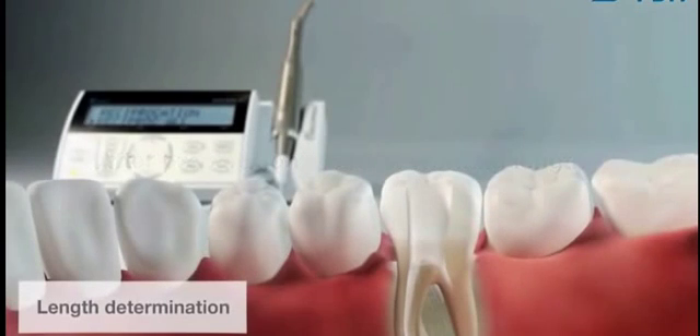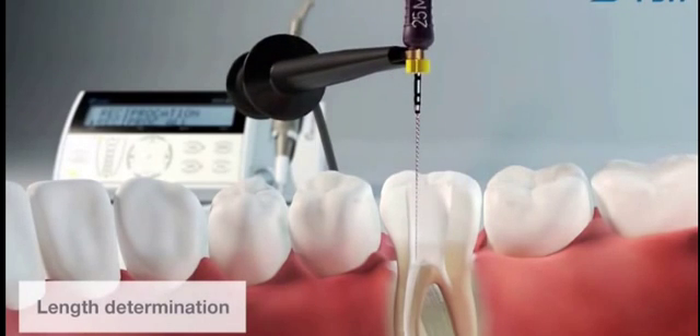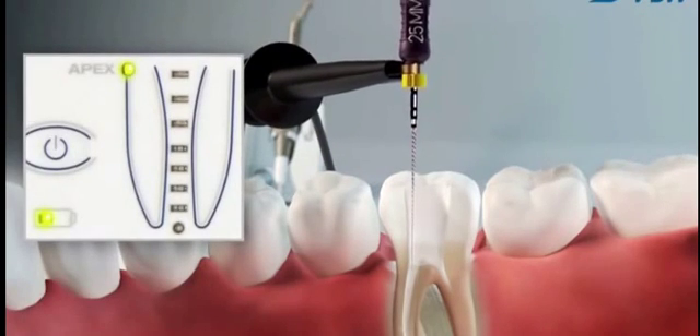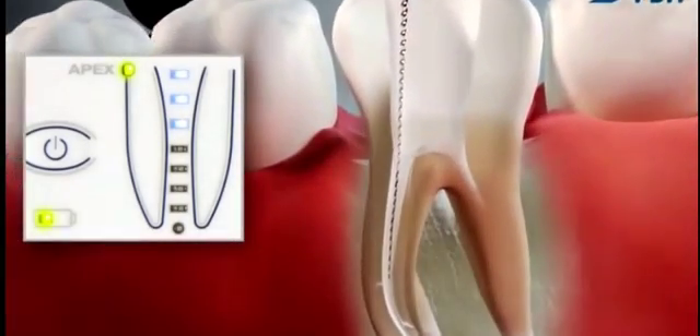Working length is now determined electronically with the help of a VDW Gold Reciproc. A C-Pilot file size ISO 10 is used both to measure the length of the root canal and to give an indication of the curvature of the canal. Make sure that the instrument is not pre-curved. Only a straight instrument will give reliable feedback about the difficulty of the apical region.